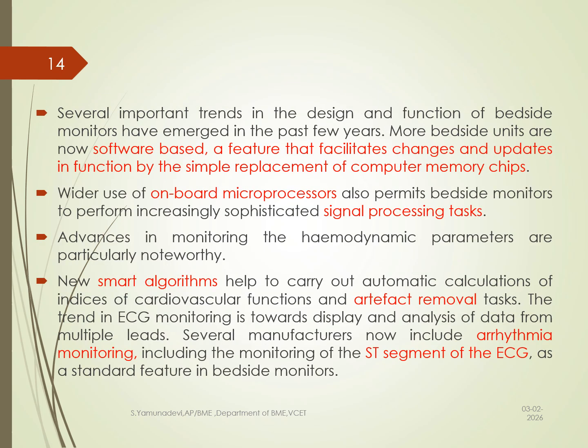Mostly the software, everything under memory storage, is easily accessible. The microprocessors in the bedside monitors provide the basic signal processing tasks, and they also have smart algorithms for artifact removal. If there is any patient movement or any lead offs, they will be detected.